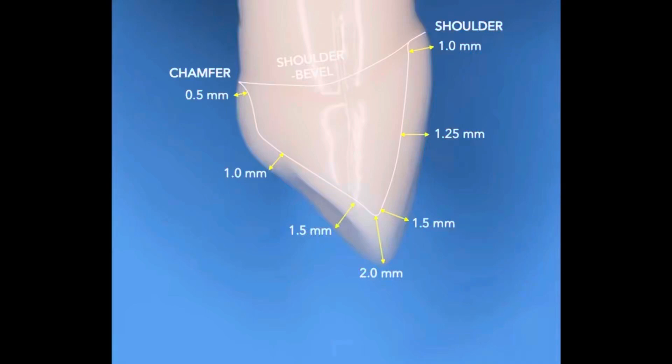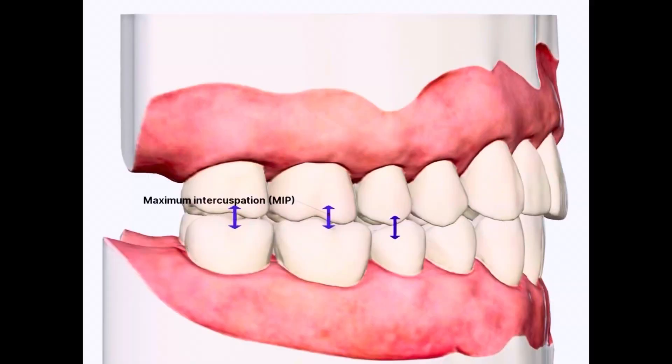In this video, we'll walk you through the step-by-step clinical procedure of canine crown preparation, from initial reduction to finishing and final checks. Let's get started with the first step.